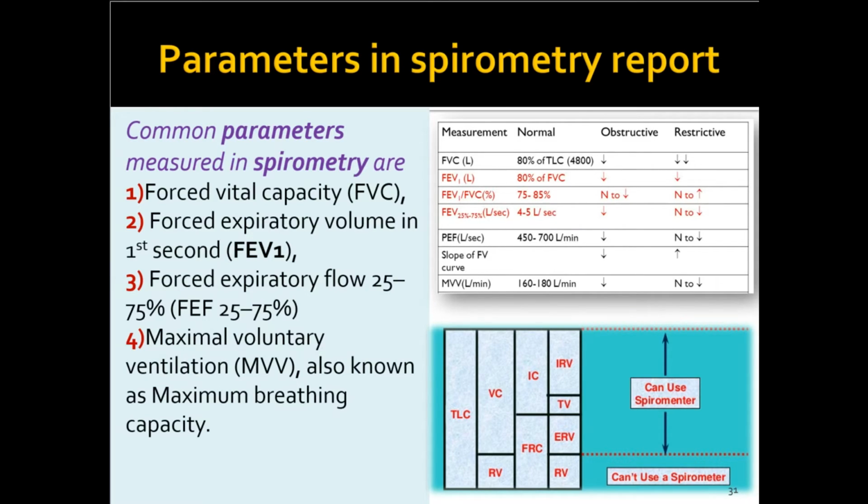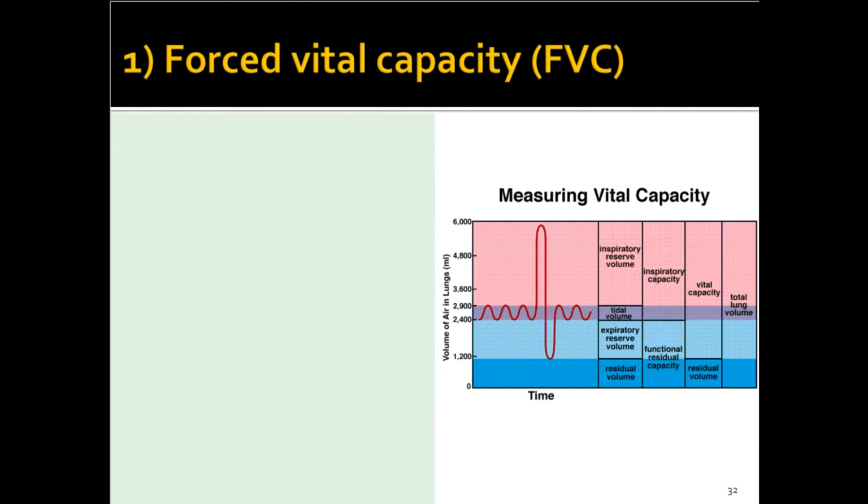Maximal voluntary ventilation, MVV, also known as maximum breathing capacity. 5. Peak expiratory flow, PEF. 6. FEV1/FVC ratio.